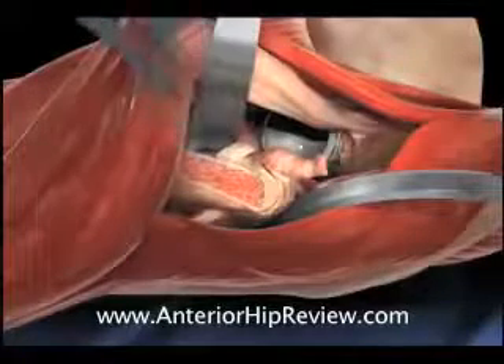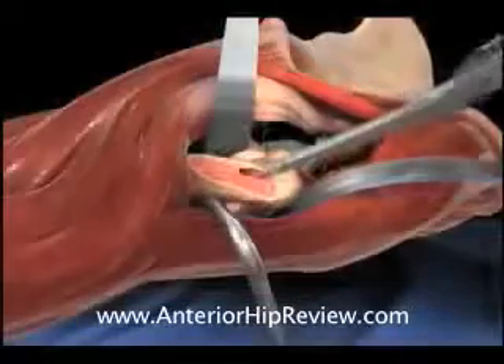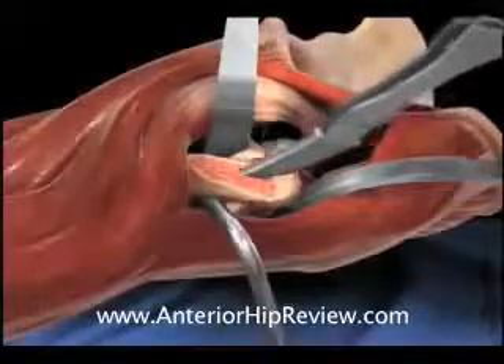A series of cutting broaches are then impacted down the length of the femoral canal, preparing the femoral canal for final implant insertion.